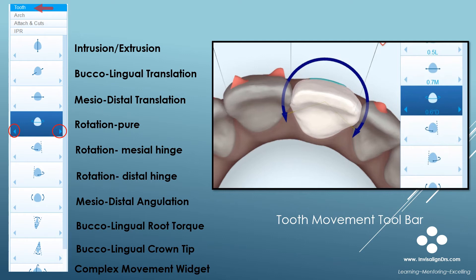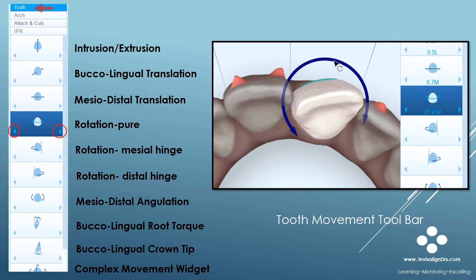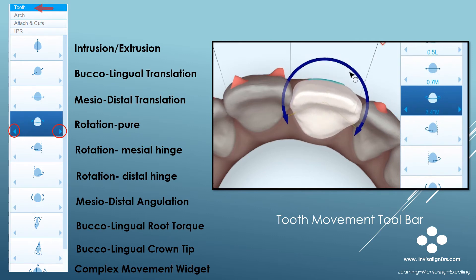I've also clicked on the rotation widget, which is highlighted in blue. You can change the value by clicking the arrows, or you can left-click and drag the arrow on the tooth for more aggressive changes. The degree of rotation change is displayed on the toolbar. Here's an example of performing rotation on tooth 9.